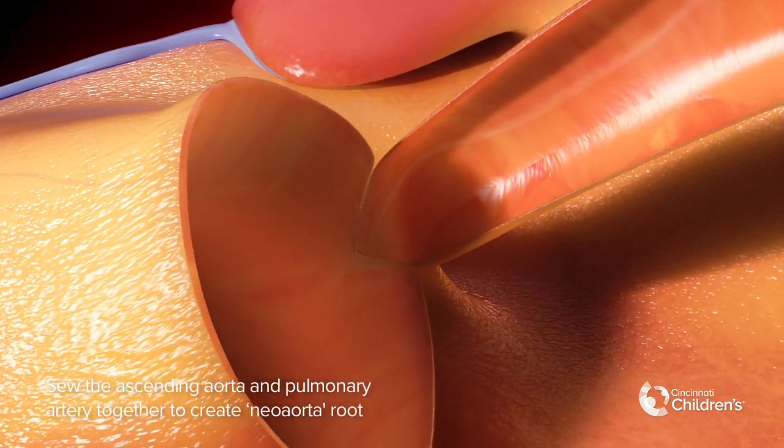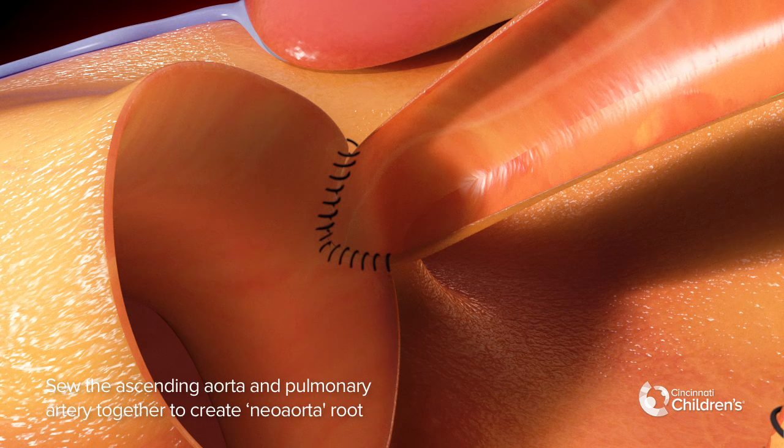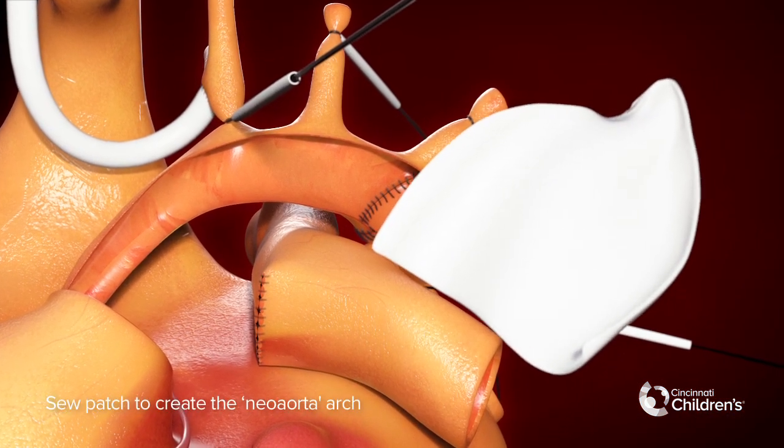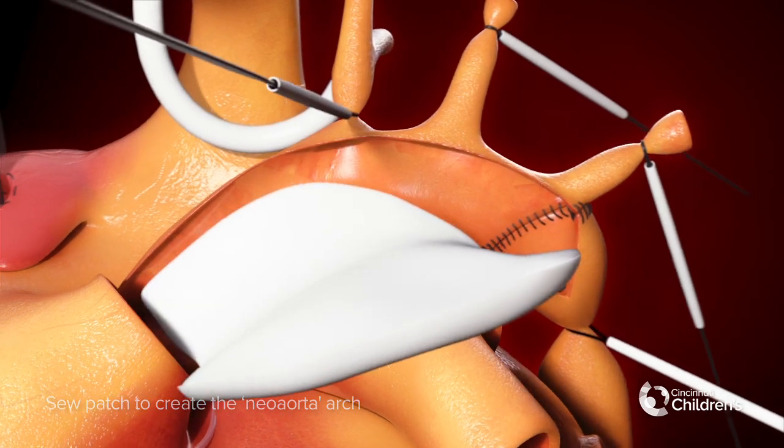Sew the native ascending aorta to the pulmonary artery to create the neo-aortic root. Use a patch to create the neo-aortic arch.